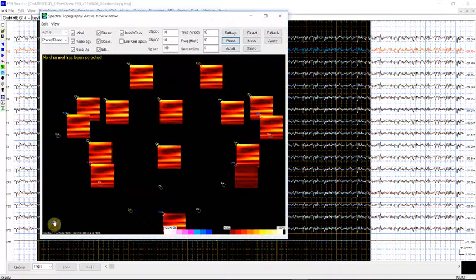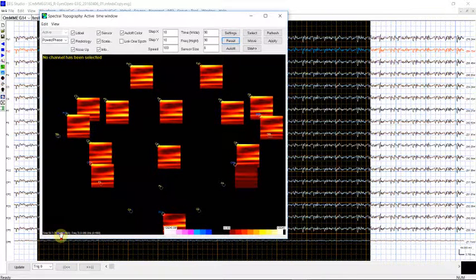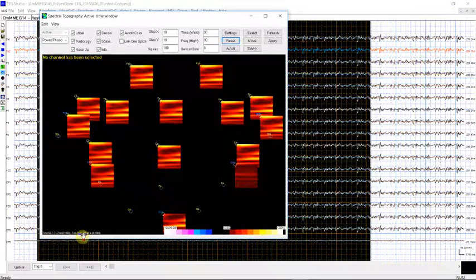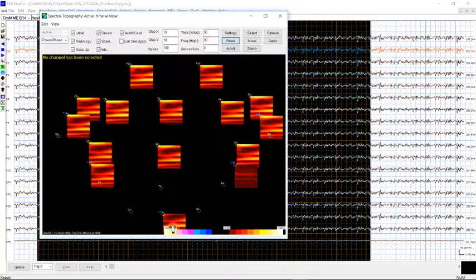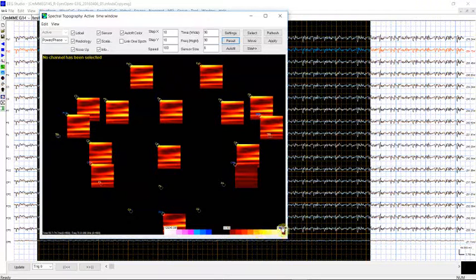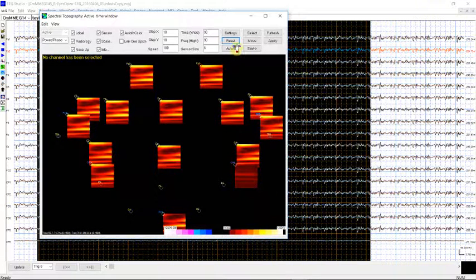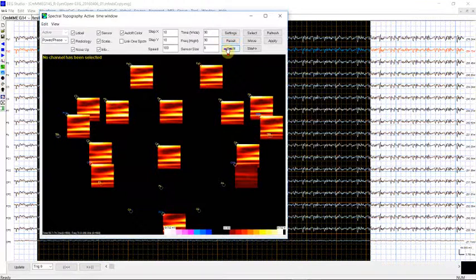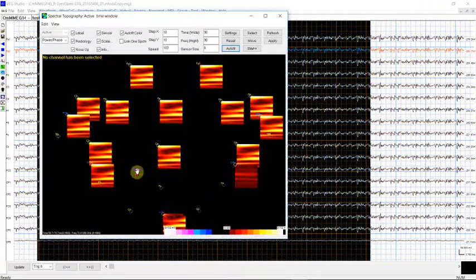Reset, you can see in the left bottom corner. This shows the time range and the frequency here. This scale shows the minimum, zero, the maximum. If you click the auto fit, it will automatically adjust the view of the parameters.